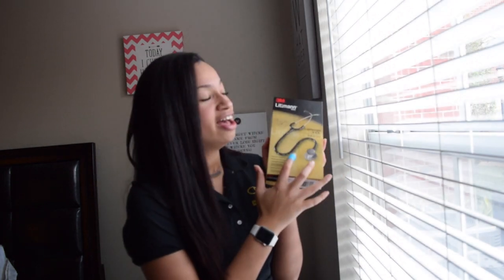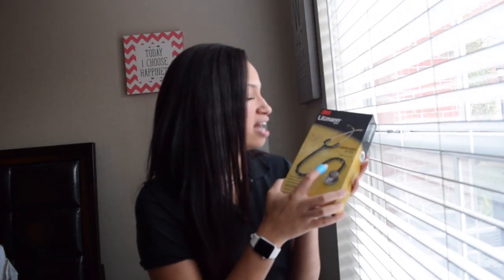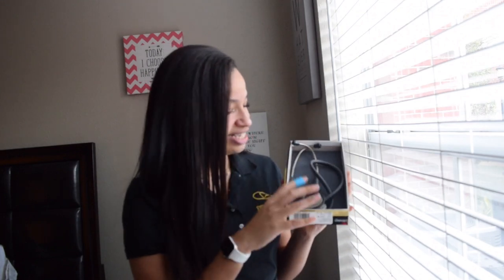Before I open the box, I want to point out that it does say you have a two-year warranty, which I think is a super good deal because you never know what's going to happen. When you open it, like I said, I have used this stethoscope before so the placement may not be the same as when you get it. In here you have your book, which has tons of different languages, how to use the stethoscope, how to clean it, things of that nature. The stethoscope itself is on top of a foam pad right here.